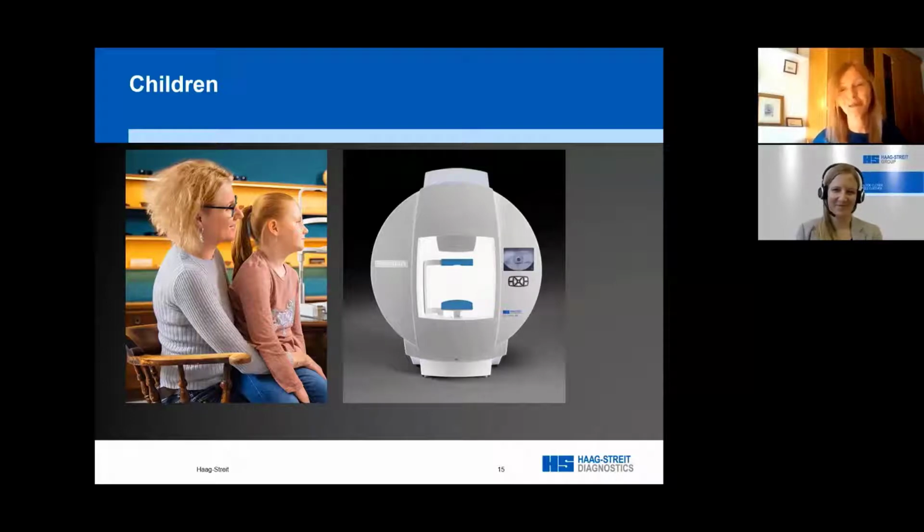And so you need to be more interactive with children if that's the case. And your testing needs to be adaptable to what the children are doing and how they're responding. And that's exactly what you have with kinetic testing. And the nice thing is that you can mix kinetic and static testing, so it's less boring for children. You can say to children, I'm going to try and catch you out. Let's see how good you are. So that interaction is really, really good.